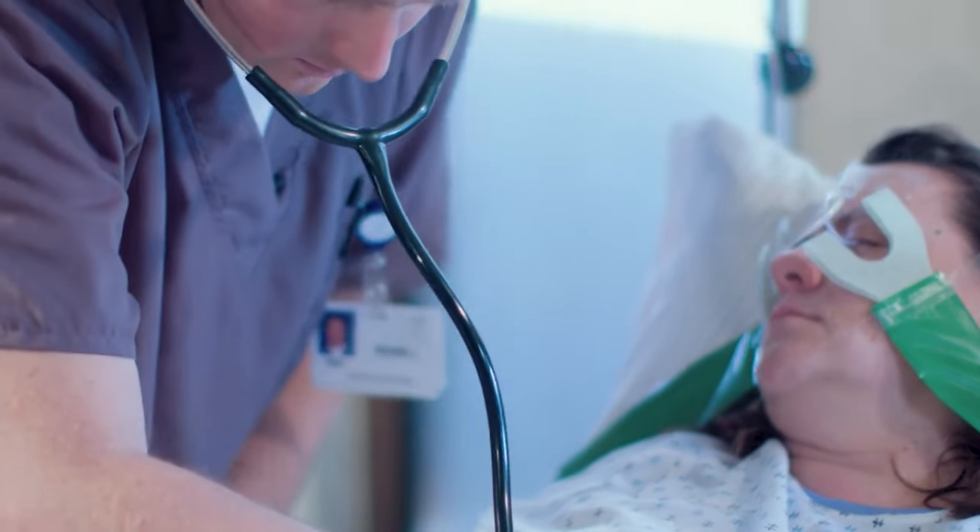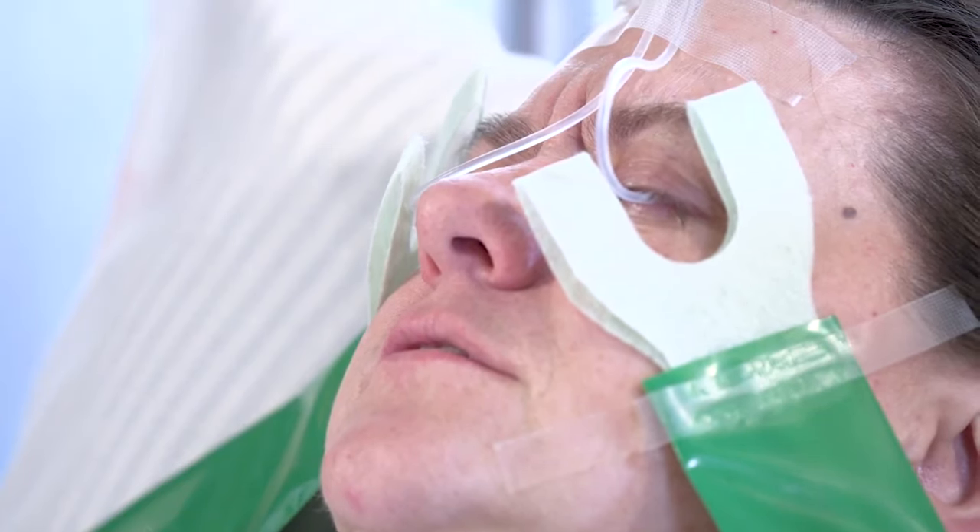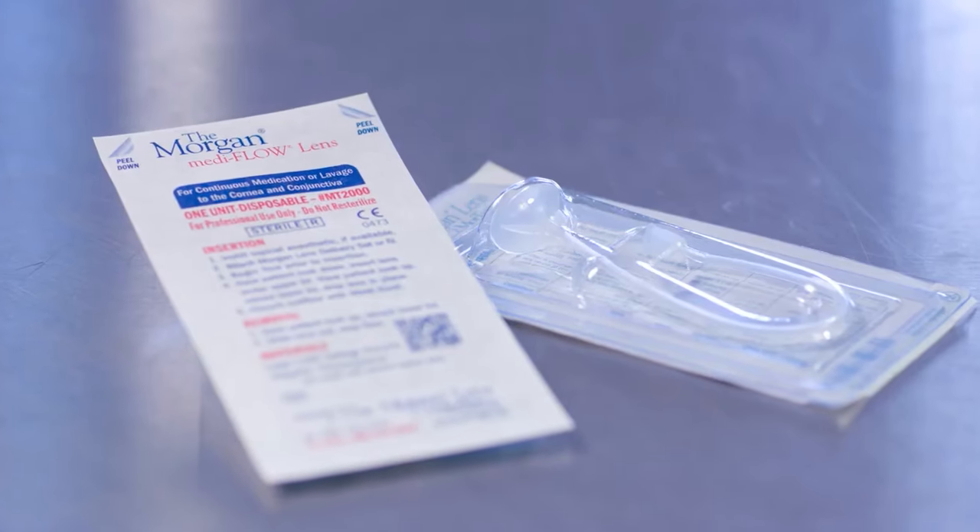Injuries to the eye are different. When a patient comes in with multiple injuries plus ocular trauma — alkali burns, acid burns, foreign bodies visible or not — the eyes can't wait.